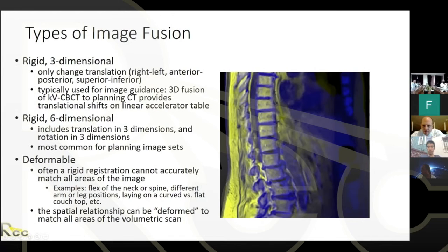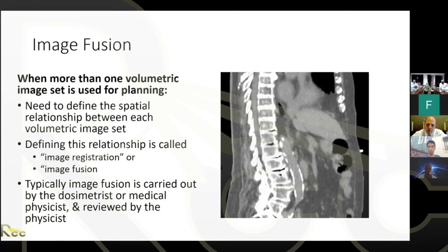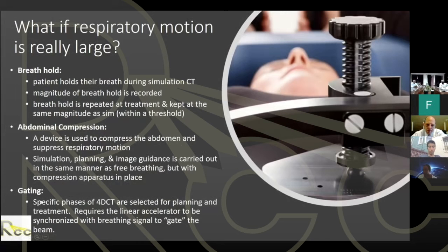Yes. A question from Contra. She's asking, is this technique, meaning gating, for lung cancer patients? If it is the case, sometimes it's really hard for them to control their breath. So with gating, you're not asking them to control their breath. You're having them breathe normally, and you're just monitoring the breathing cycle. And as long as the breathing cycle is regular, then you choose specific phases of the cycle that the beam is on. So the beam will be on while they're usually in exhale, and then it turns off while they inhale, and then you wait till the next exhale to turn the beam on again.